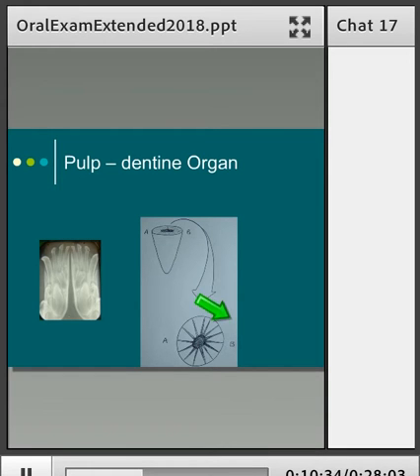then you'll see in this radiograph of a young puppy how we've got a whole series here of deciduous teeth, and that they're sitting here right above the developing permanent tooth buds, and how there's very little bone actually, but in fact there's really very little hard tissue at all. So if we have a little look at that bud, for example, of a canine, then really a lot of it is quite lucent because most of it is basically made up of pulp, and it's a very, very thin shell there of our dentine and then enamel.